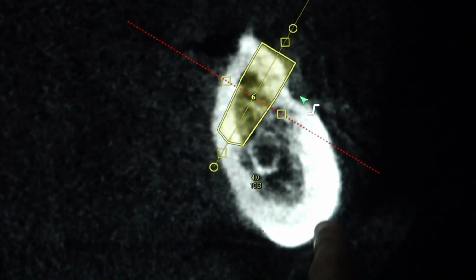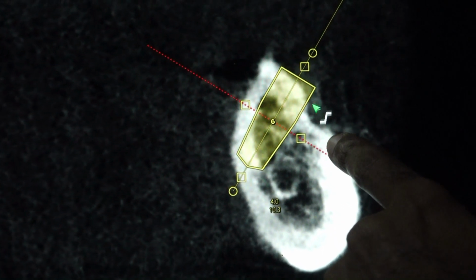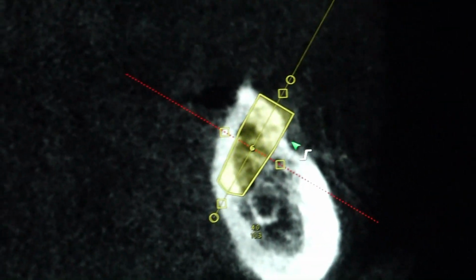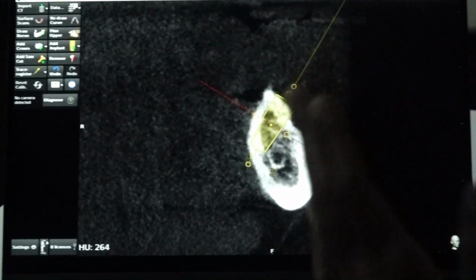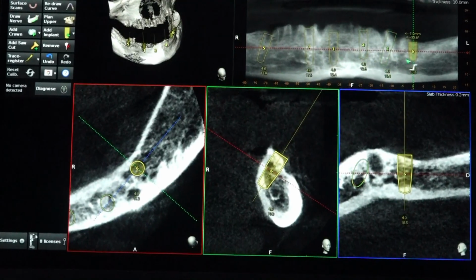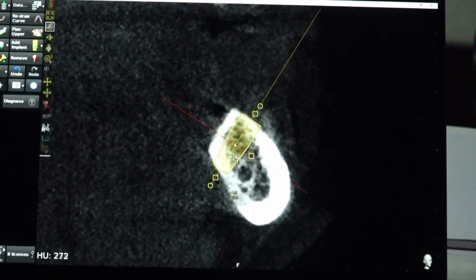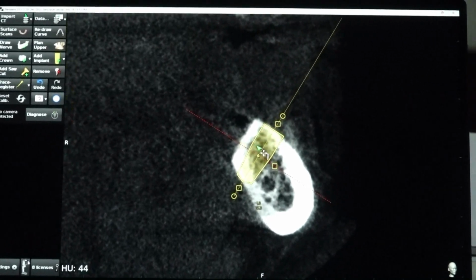Okay. The problem is the mental foramen distally travels, creating a depression here. Imagine if we drill from here, we may injure the mental foramen. The mental foramen exits in the second premolar area, but it travels till the first molar area, creating a depression and channel. So better in this case, we will start implant placement in the second molar area, which is very ideal. Even there we have got a good myelohyoid ridge. The only thing is we have to drill properly.